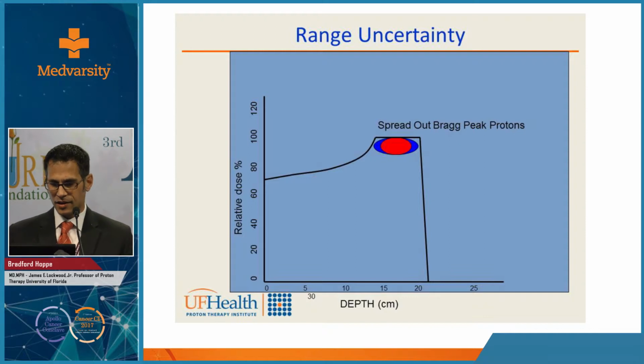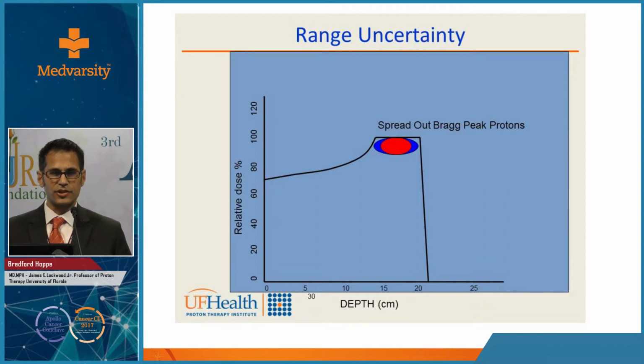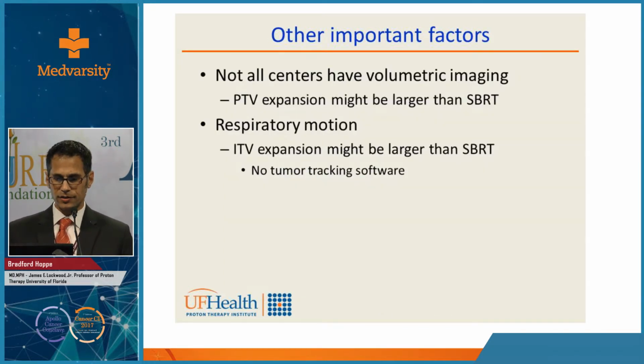That being said, if you look at the center, the area in red, the high dose area, you can see that it's actually a little bit worse with protons than what you have with the SBRT with photons. And so this is an important concept to be aware of. Part of the reason is that there is some uncertainty in how deep we're delivering the protons. Because of that uncertainty, we don't just deliver the treatment to the depth of the tumor, but we add a little bit of a margin, both anterior and posterior to the tumor, to ensure that we get full coverage. This is something that we don't necessarily need to do with photons.